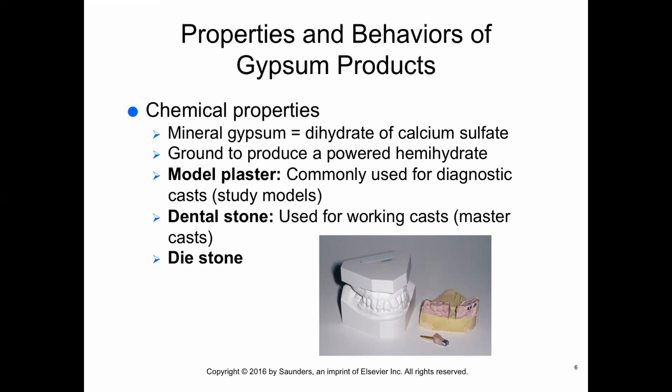Even though there are differences in the three types of stone, the accuracy of each relies on the accuracy of the impression from which they're poured. Their use depends on which gypsum material is used and the properties of the material.